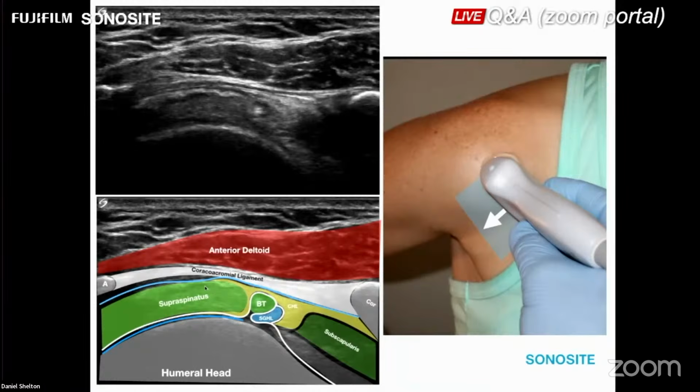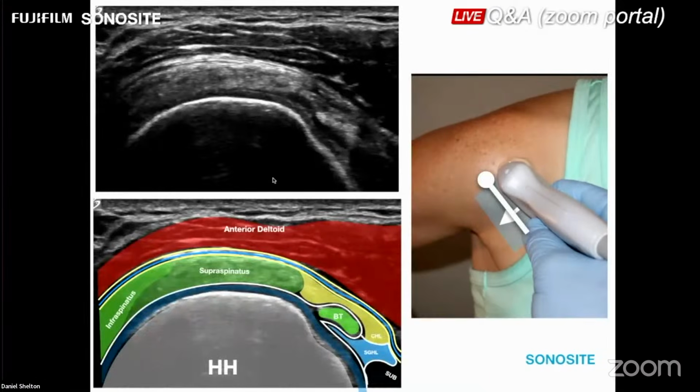It will not change as we fan this transducer distally down the greater tuberosity, and we're going to look for the shape of this humeral head to change. So unless you have a rounded humeral head, I don't want you to advance the transducer, okay? So we've advanced the transducer to this new white location here. You can see this big dot, just like in our last set of slides, and in the wrist, is going to represent the left side of the screen. This thumb orientation marker in the transducer is the left side of the screen.